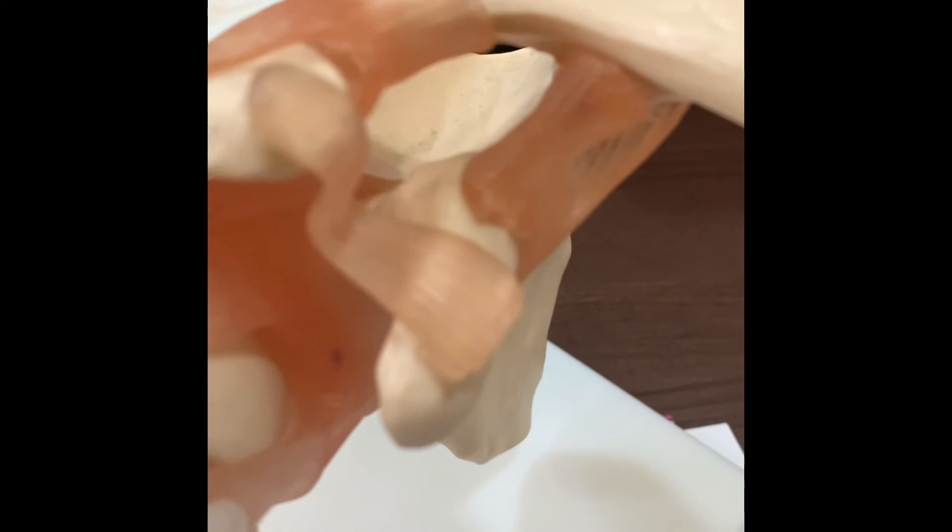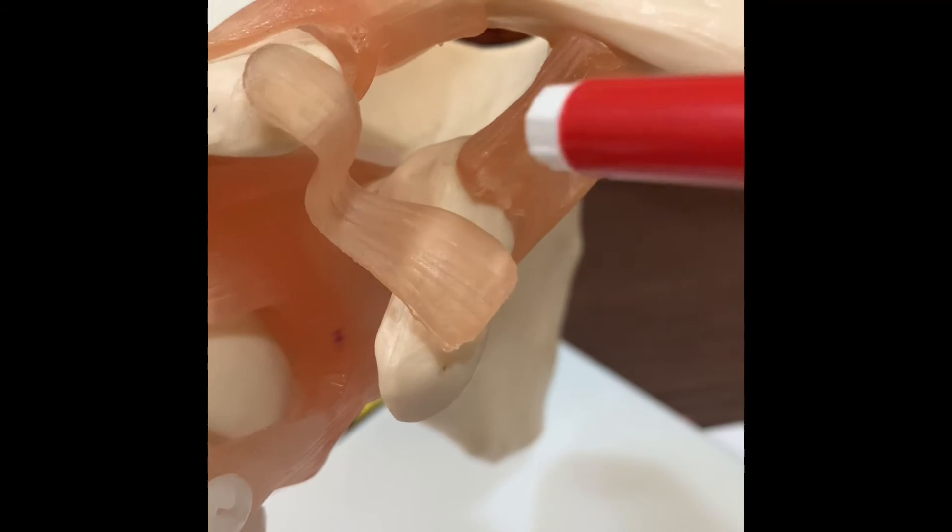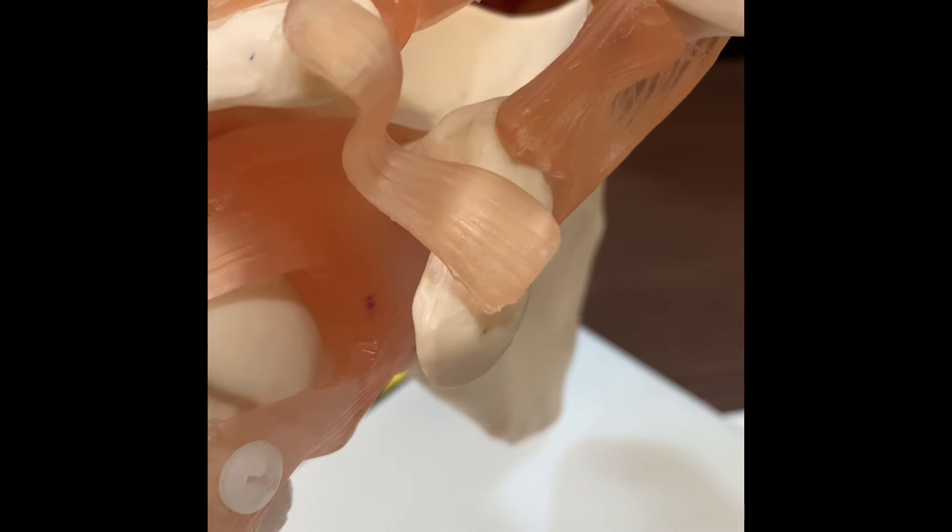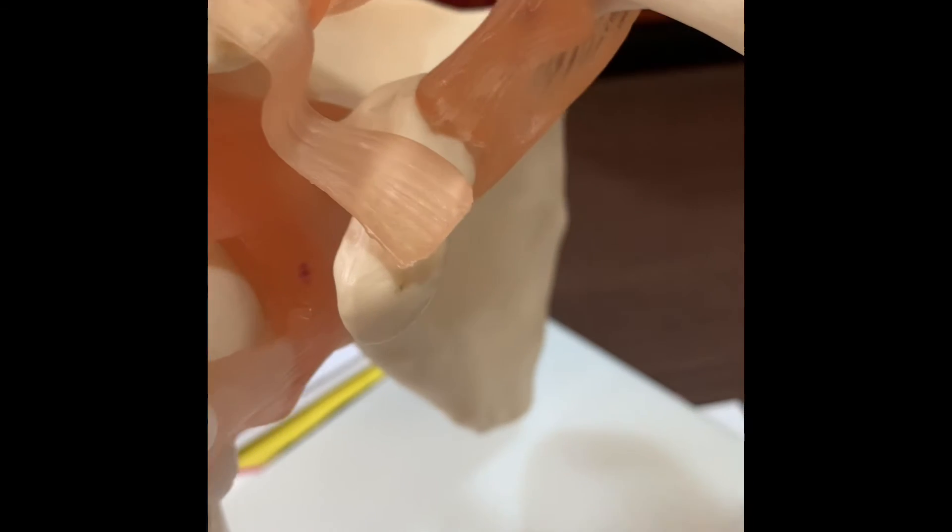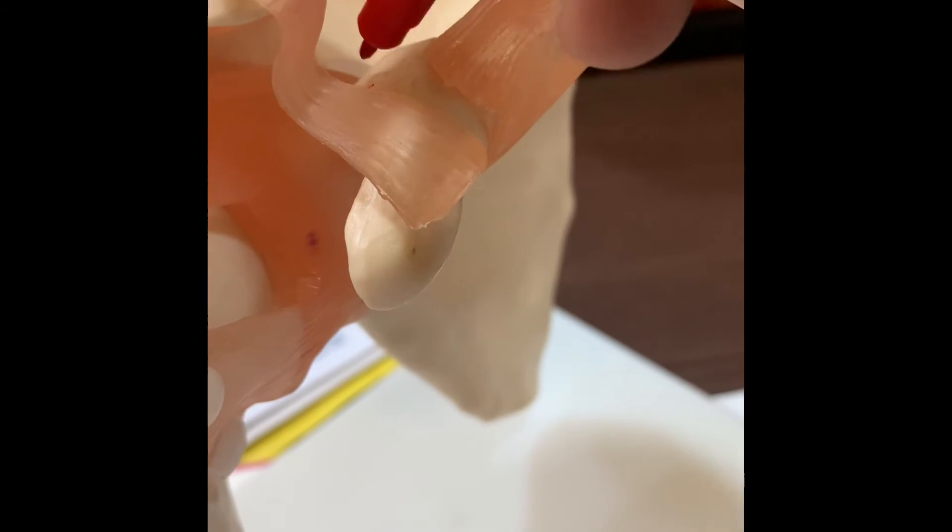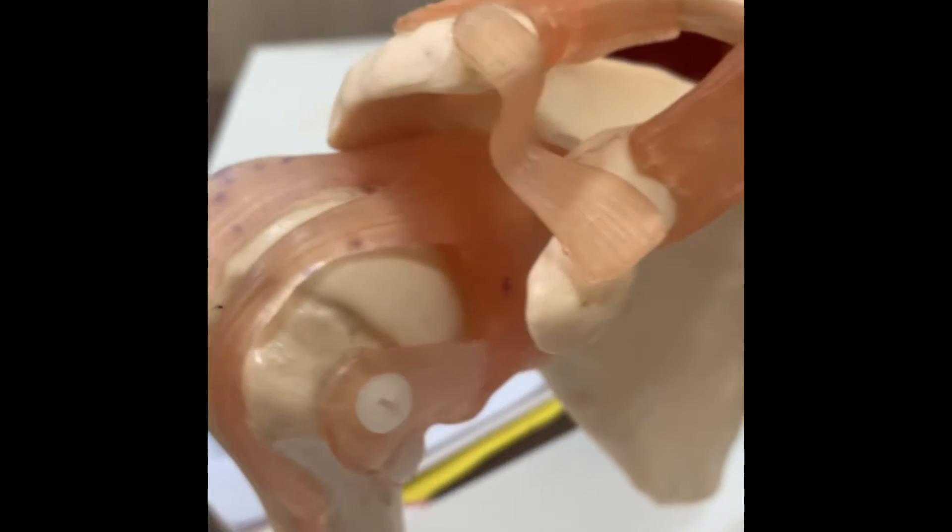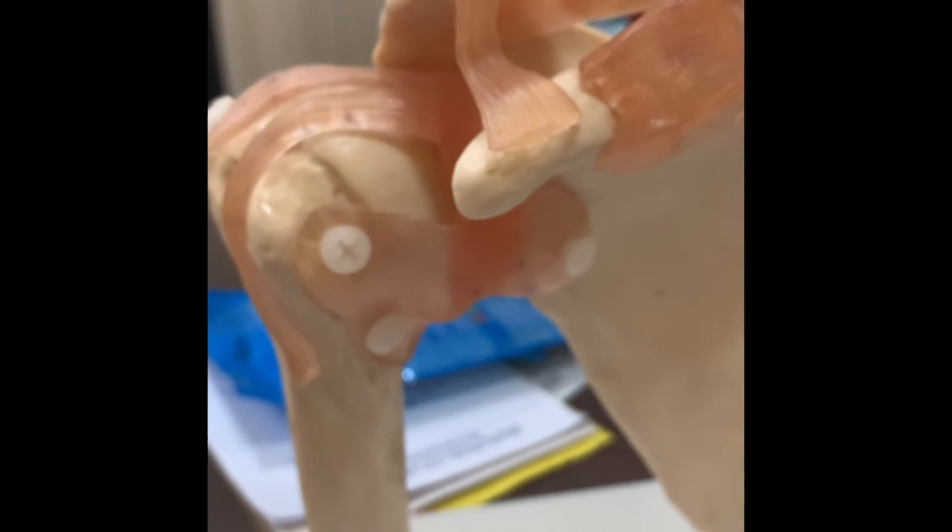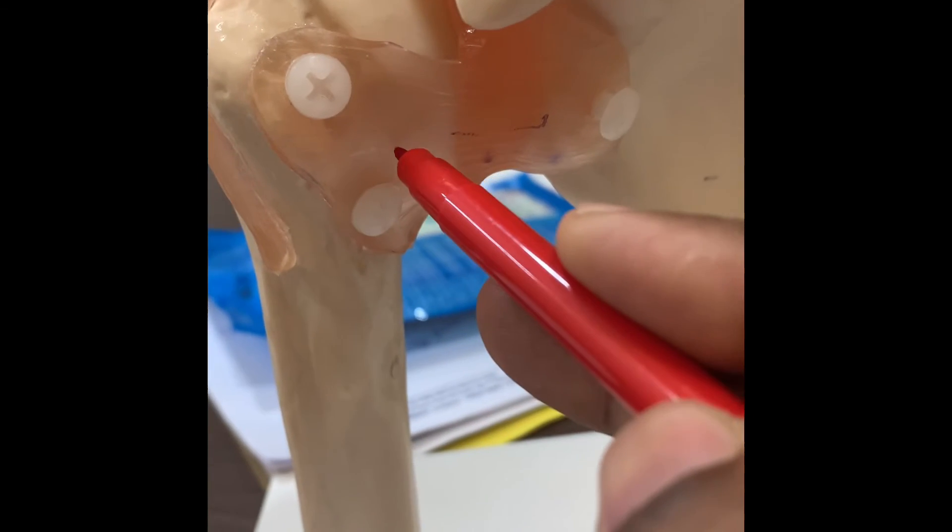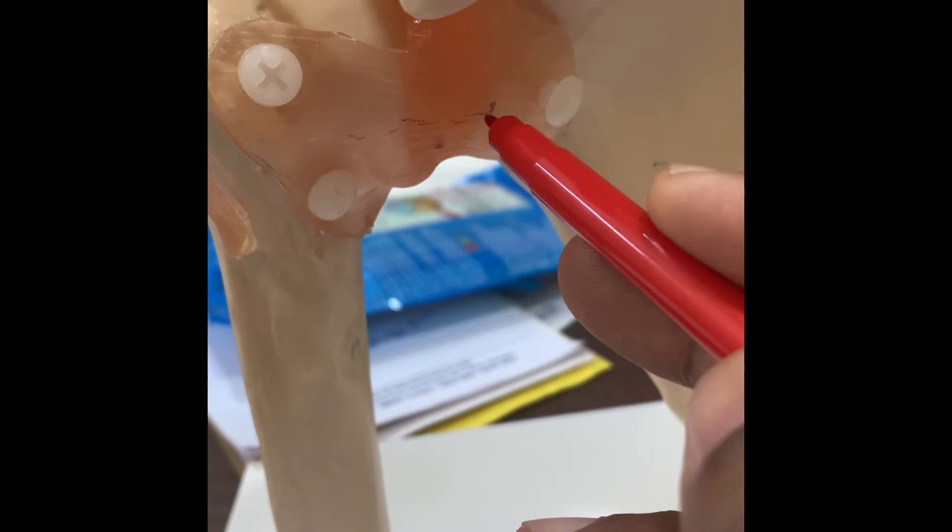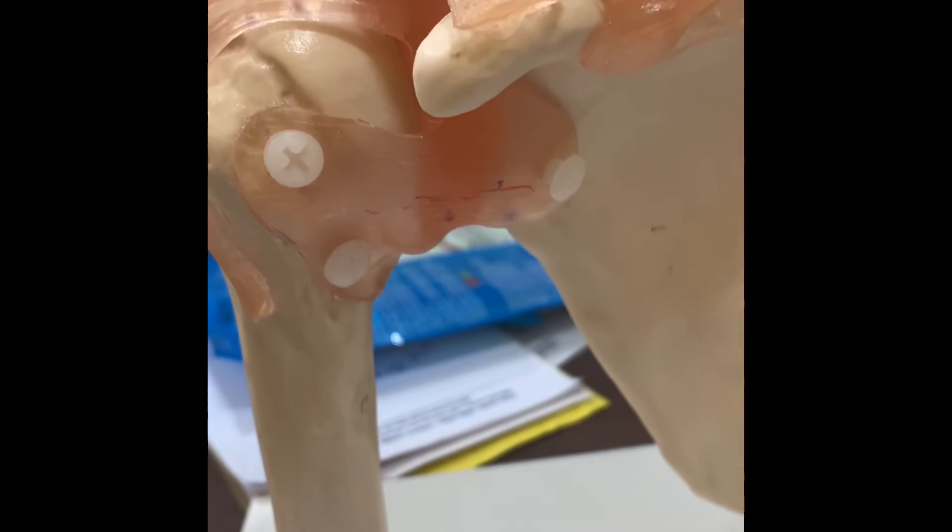The coracoid is cut near the base and placed in front of the socket. The marking shows where exactly I cut the coracoid. Then we make a split in the subscapularis muscle in the front to expose the socket.